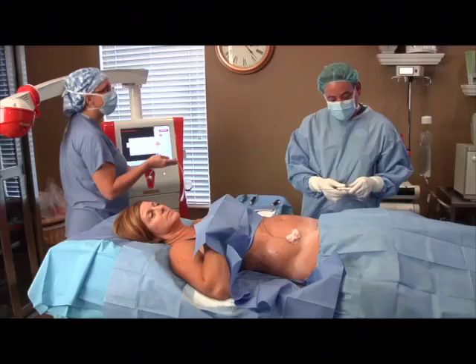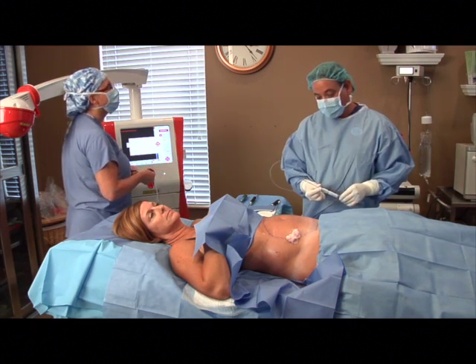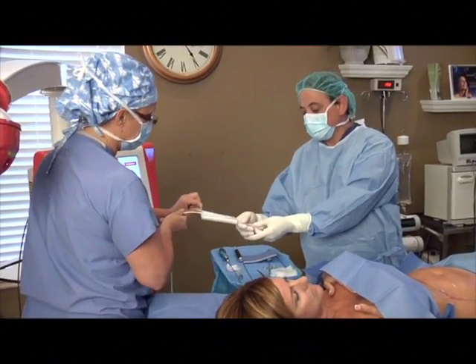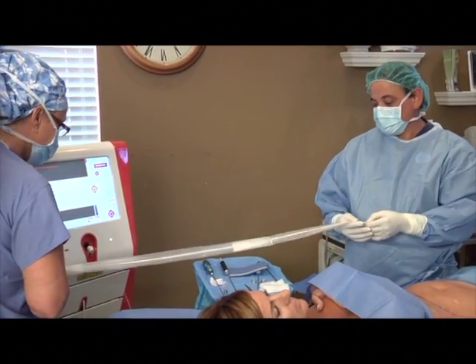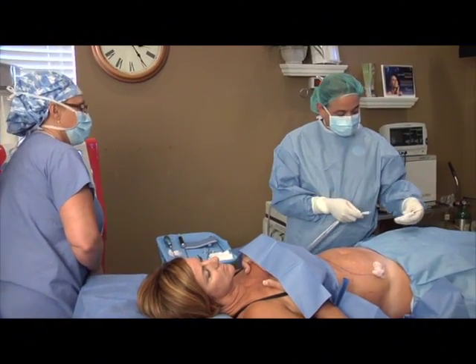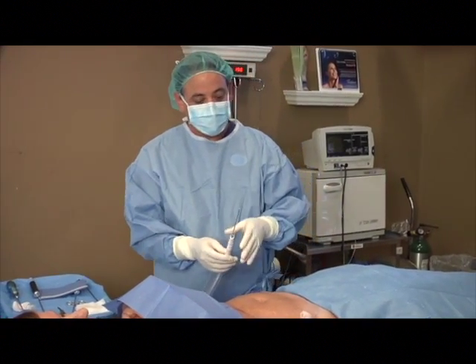So right now we're setting up the laser fiber and pushing it through the little port that we're going to use to insert into her skin. White cord now. This is the GPS device, the tracking device that's being connected to the machine. It goes into the back of the cannula or probe to monitor my hand movement.